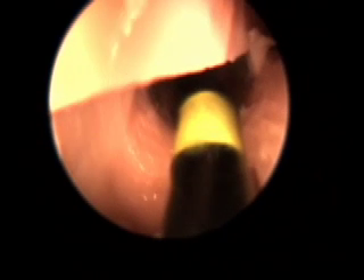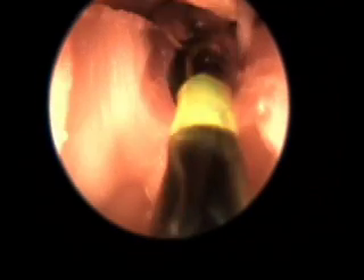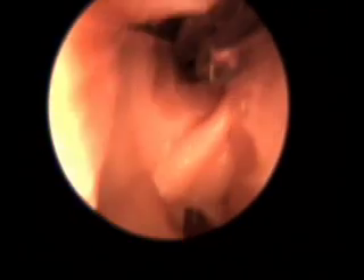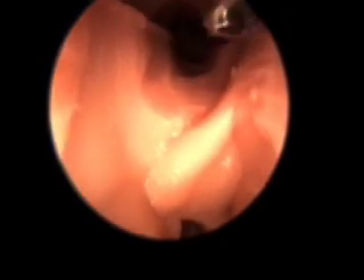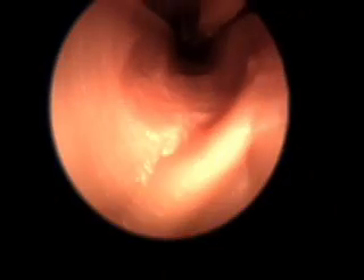After about three seconds, the balloon is deflated and then removed. This method allows for enlarging the opening into the frontal sinus cavity without causing any mucosal or bony damage. This allows for fast recovery and minimizes any potential scar formation in the future.